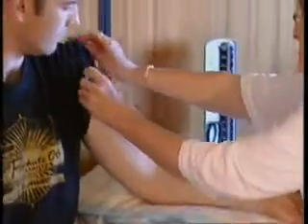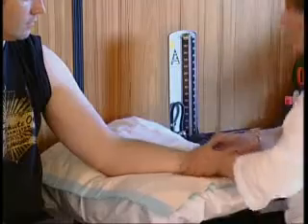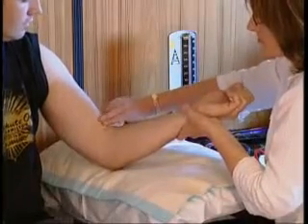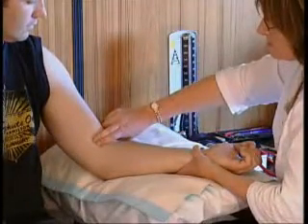Expose the arm fully. Locate the brachial artery. It usually helps to extend the arm to locate this artery. Note the position and return the arm to the slightly flexed, relaxed and supported position.